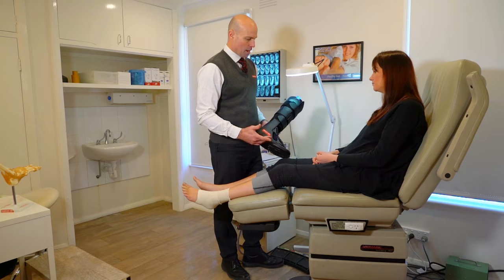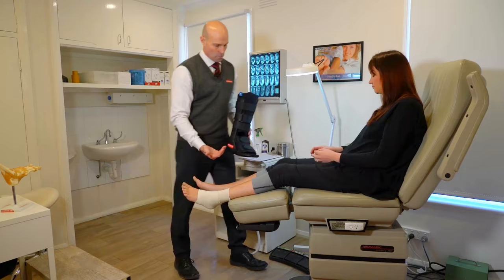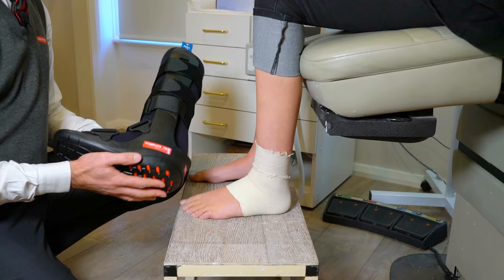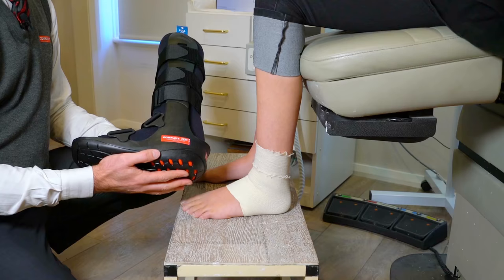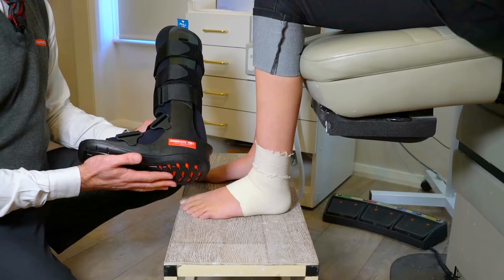So Mel, this is your CAM walker. It basically has three parts: the frame, the liner underneath, and the circumferential straps — that's going to help immobilize your foot and ankle to help it heal. This is your Complete Feet CAM walker; there are four different types and it needs to be customized to your foot, ankle, and your injury. That needs to be done professionally, and that's what we do here at Complete Feet.